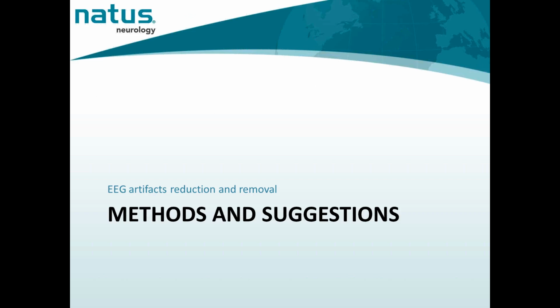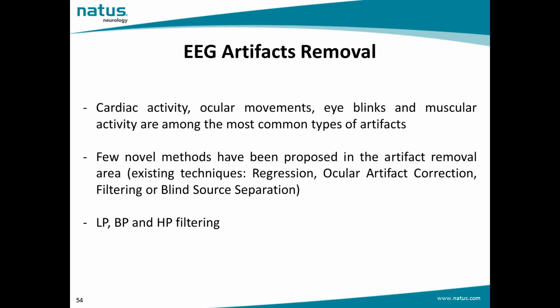In the last part of this webinar, we will discuss the methods and the suggestions for reducing or eliminating the EEG artifacts. As we saw in the first part of this presentation, artifacts are undesired signals that may introduce changes in the measurements and affect the signal of interest.